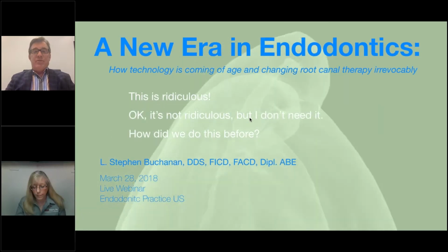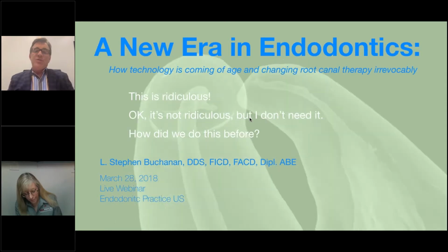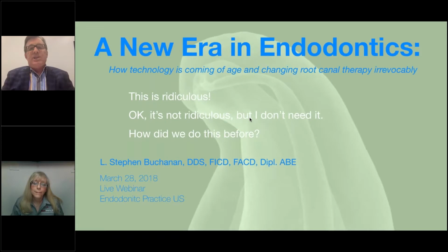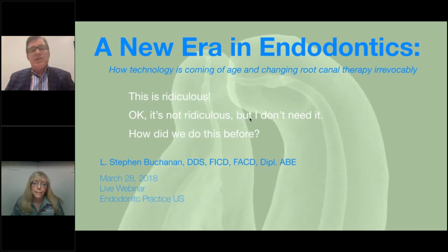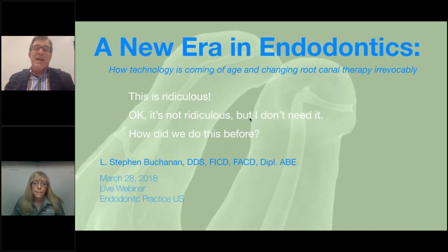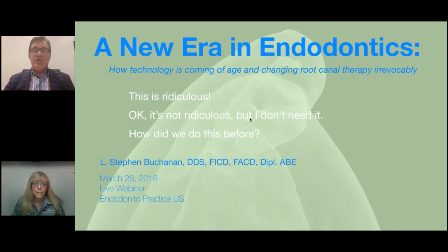Virtually zero. If I tell clinicians who ask this question, have you ever used a computer video game? And they all say yes, of course. And it's like, well, did you watch the controller or did you watch the TV? And this isn't any different. The controller is your hand and the handpiece, the tube. You can see better on the TV monitor than you could looking in your mouth.